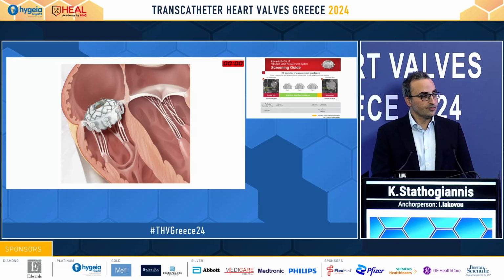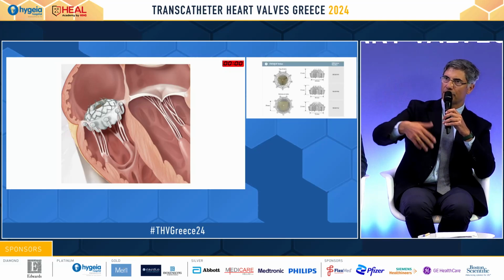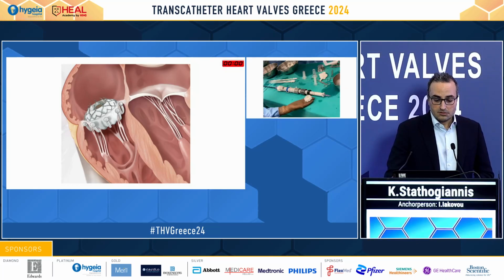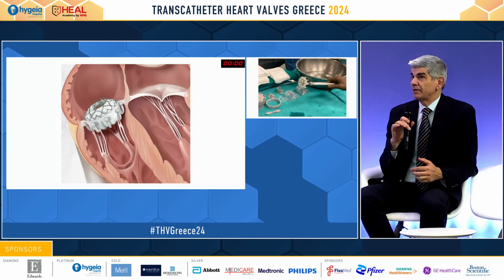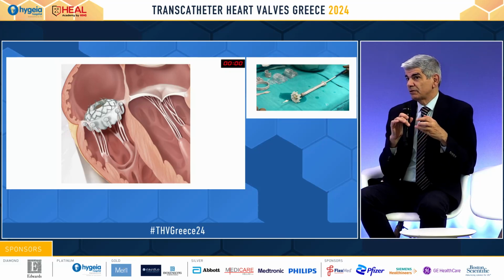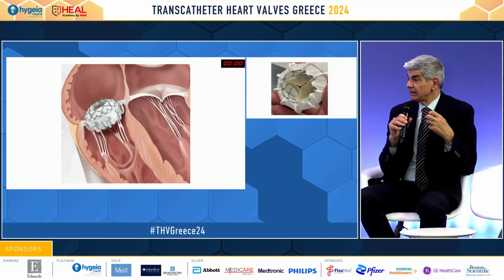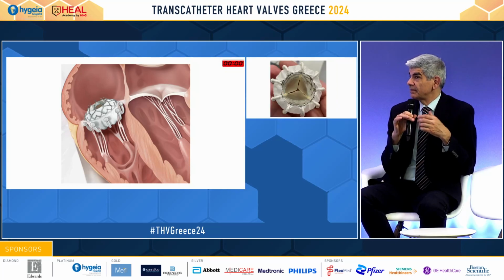Okay. So do you foresee any major changes in your practice? When you deal with severe TR that is in the yellow zone or red zone for TriClip or Pascal, you would go ahead and place the Evoque, I suppose, right? Yes, I think if anatomically they're not suitable for edge-to-edge repair, then that's the only thing you have as an alternative. But if they are suitable, then you really have to convince yourself that you're going to have a durable and good result. Nowadays, when we do edge-to-edge repair in the tricuspid, we think very carefully about our results, and we're very mindful that if we don't get a good result and we implant a Pascal device and have a moderate residual, then the patient does not have any other options.